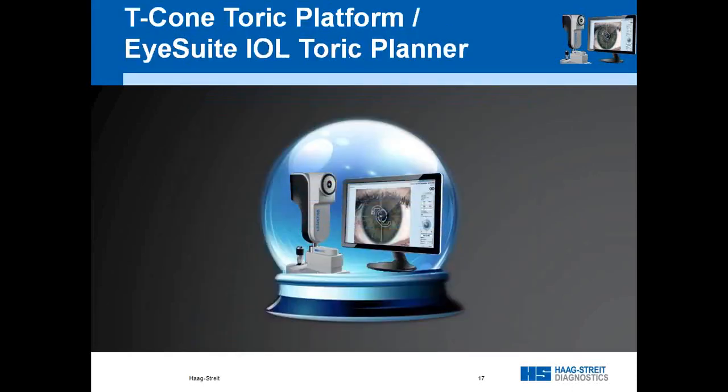So this all was about the calculation of standard spherical IOLs. Now we all know that there are plenty of patients out there who have some amount of astigmatism. It starts at half a diopter and goes up to quite high amounts. A significant number of patients could be treated with a toric IOL, even at the lower powers which are available now. But how do we best calculate the IOL power and the cylinder power in these cases?